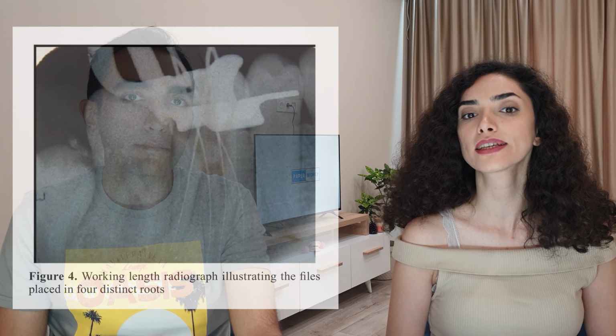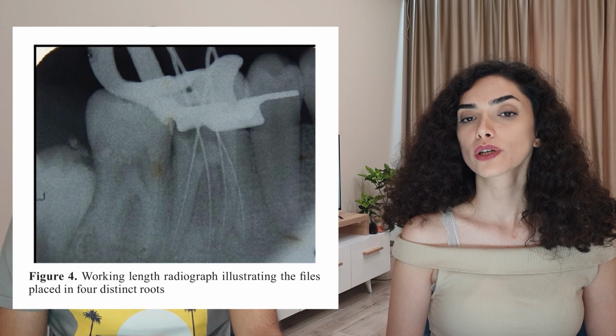Well, they encountered a bit of a challenge with the entrance to the distolingual root canal orifice. It was blocked by calcification. They managed to clear this blockage using ultrasonic tips and gained access to the canal. After negotiating all root canals with a 10K file and confirming working lengths, they used a crown down technique with ProTaper Gold rotary files. Cleaning and shaping involved sequential irrigation with sodium hypochlorite and EDTA.